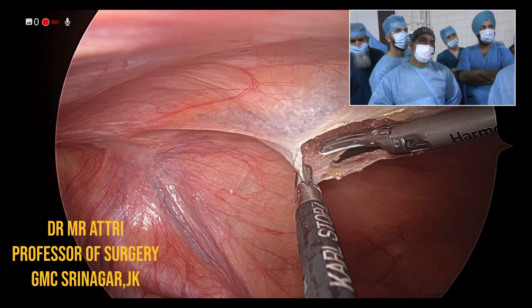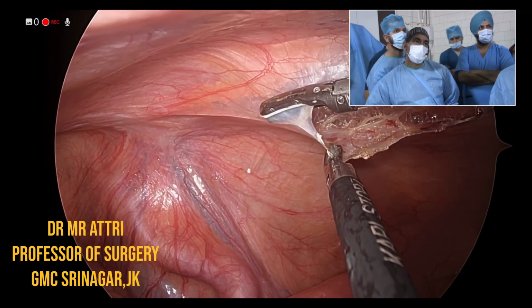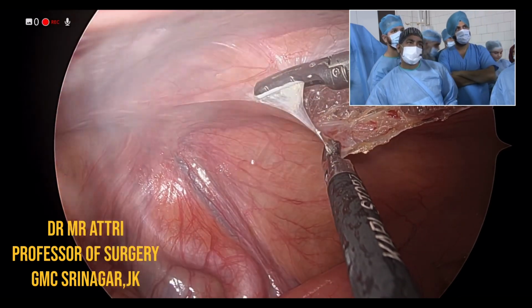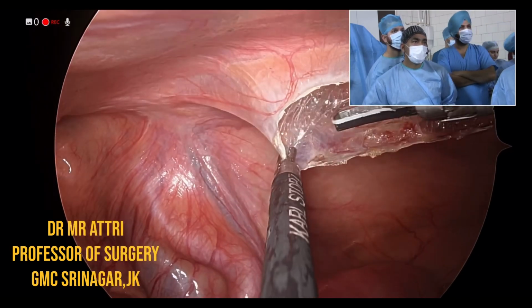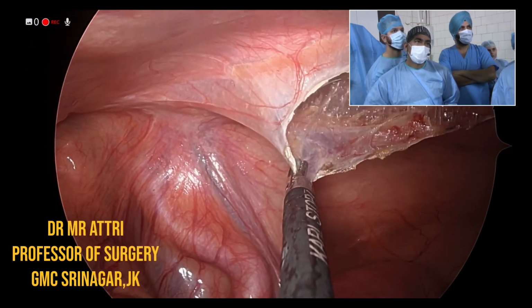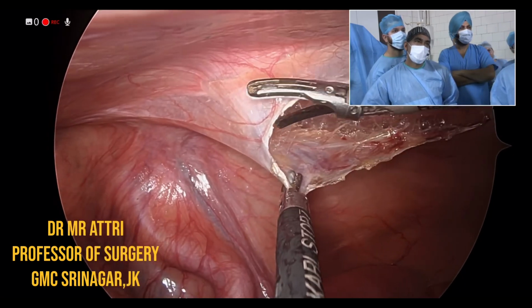And we have to inform the audience that Professor Ratri is well versed with the use of scissors, but just for demonstration purposes, he is using a harmonic. We believe that the right instrument should be used at the right place. Harmonic is not a cheap instrument, but we want to demonstrate all the products that the companies have put forward that way.